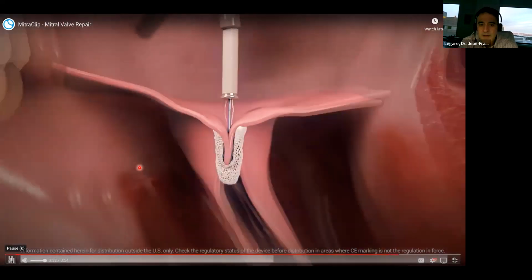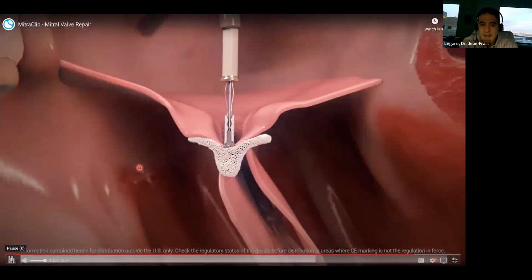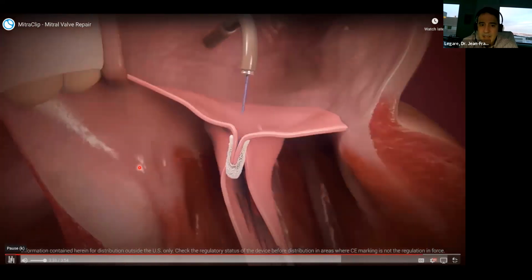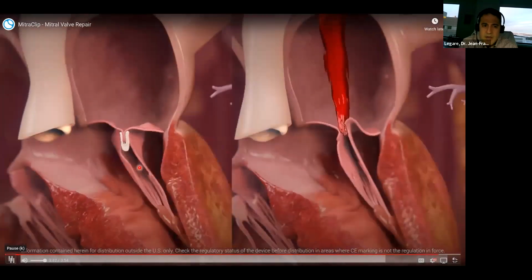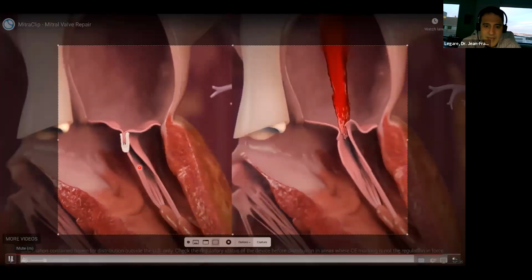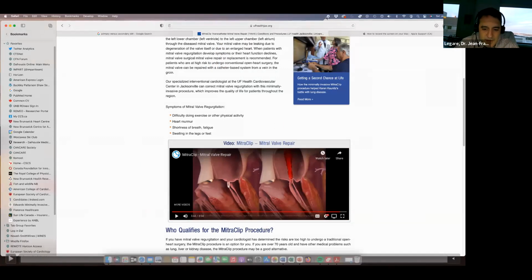And a large amount of the time, we end up using 2 clips, not just one. So you can start at the worst part, and there are some technical challenges on the second clip, making sure where you put it, to make sure your second clip is going to be a little bit easier than the first. And then you release the clip, and essentially this is what you have. And hopefully you've made that better. So from a technical point of view, until you get it clipped, it can take from minutes to hours in terms of getting that organized. It seems like a simple procedure there, but it's taken us hours over time. So hopefully, if I can make my next, there we go.